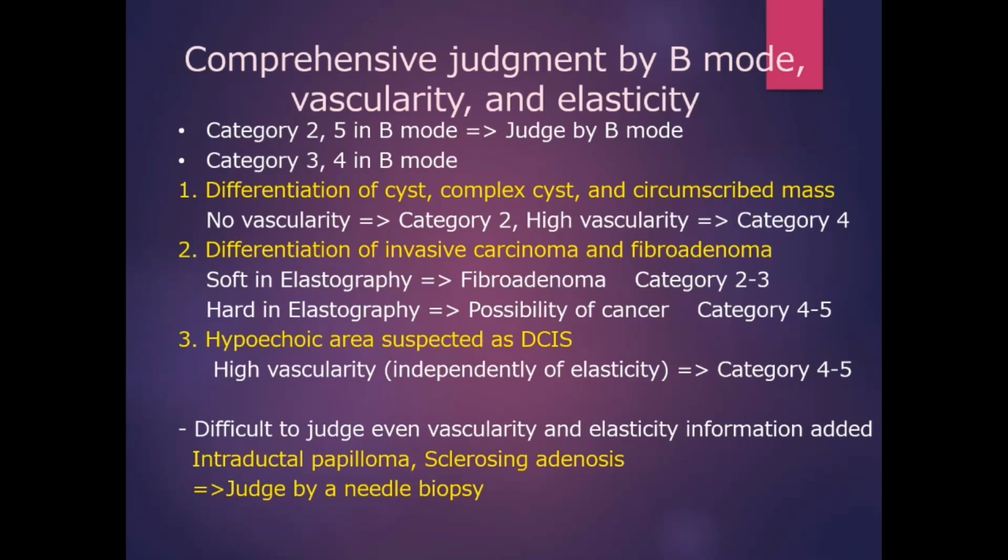In differentiation of DCIS, if it has high vascularity, conduct a needle biopsy. Intraductal papilloma and sclerosing adenosis are difficult to judge even after adding vascularity and elasticity information.